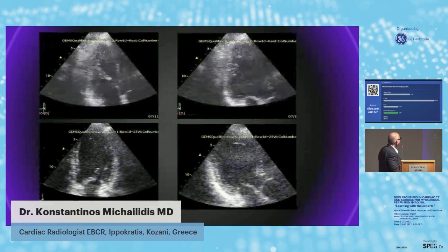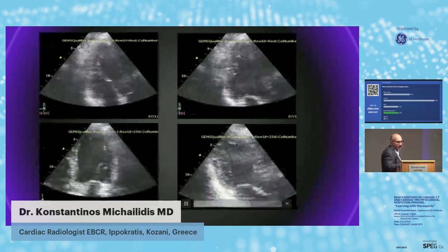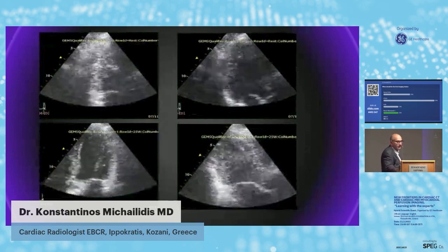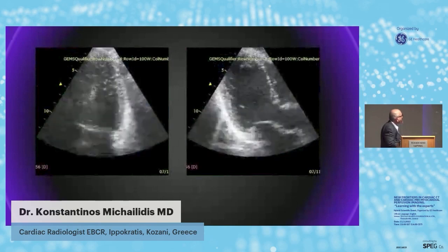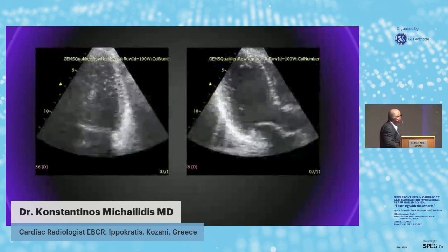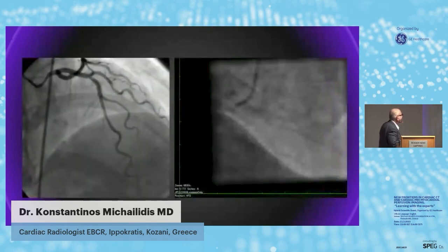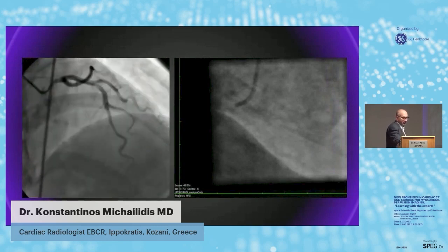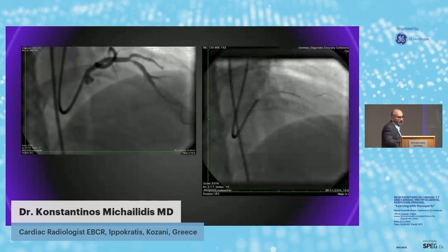So we have here with the low energy acquisitions that there is no regional wall motion abnormality. And here with 25 watts of bicycle effort, there was no change. And then we can see here that at high effort, 100 watts of loading, the anterior wall is hypokinetic, it does not thicken as well as it was doing before. So, Dr. Michailidis, please use the cursor in order to see. We can see. Okay, thank you. This one. Okay. So what happened later on?